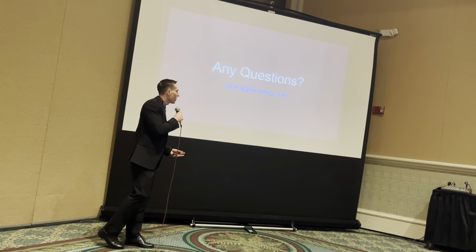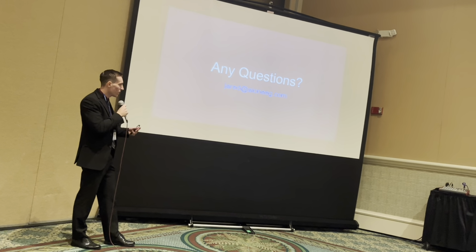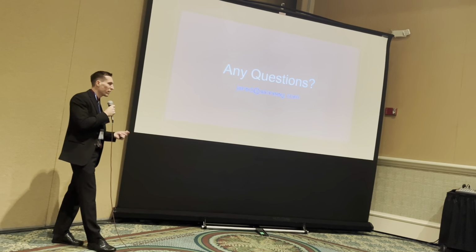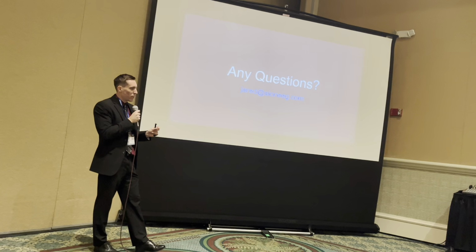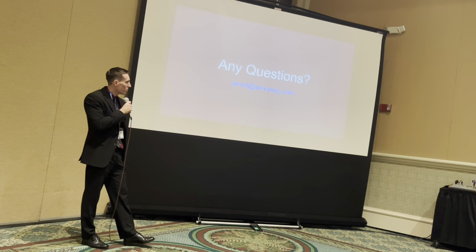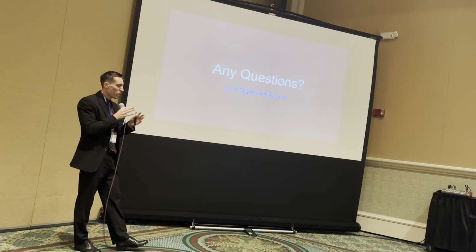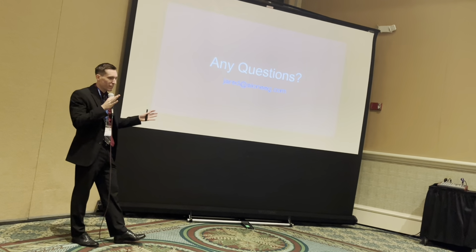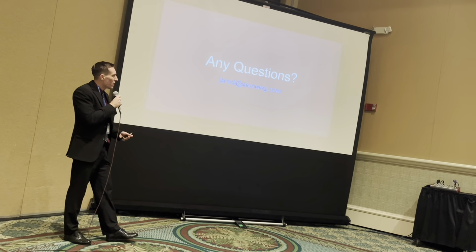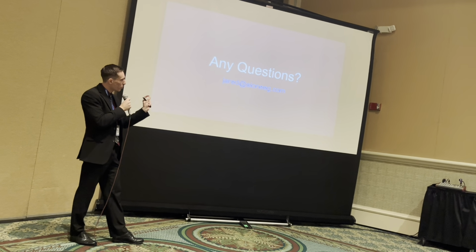Yeah, very good question. So he was asking, what is the best time base or time frame to look at when looking at quantitative EEG? That's a very important question. I usually like to look at about an hour at a time, because if you try to look at 6 hours on one page or 12 hours on one page, you can miss subtler things like very short seizures.